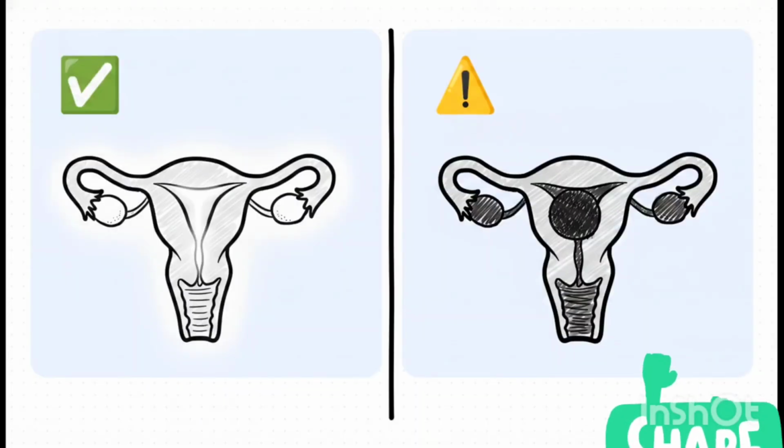Take a look at the striking contrast on this scan. On a normal uterus, you get this beautifully homogeneous myometrium with a distinct, bright echogenic line right down the center. That's your endometrial stripe. But throw a fibroid into the mix, and bam! That smooth contour is totally distorted by a dark, hypoechoic mass. Recognizing that smooth, normal baseline is the only way you'll reliably spot the abnormal.